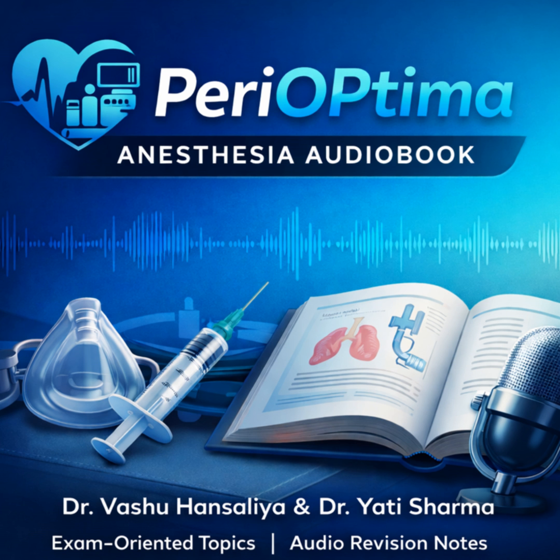The MGPS is reliable. It comes from central sources like liquid oxygen tanks, but you need redundancy. Because pipelines can fail. They can be cross-connected, the wrong gas can be supplied, human error can always override protocols. So before we even get to the machine, there are safety mechanisms built into the system itself, right? The connections. Yes, and these are often short-note questions.